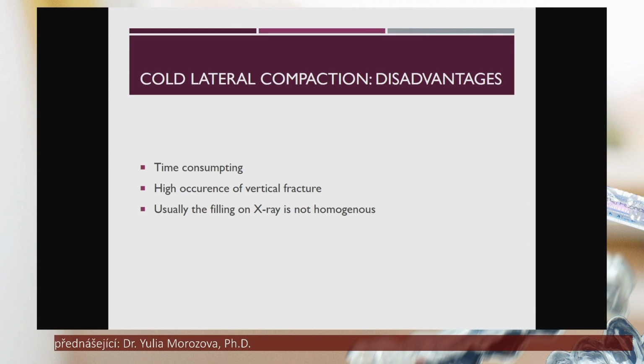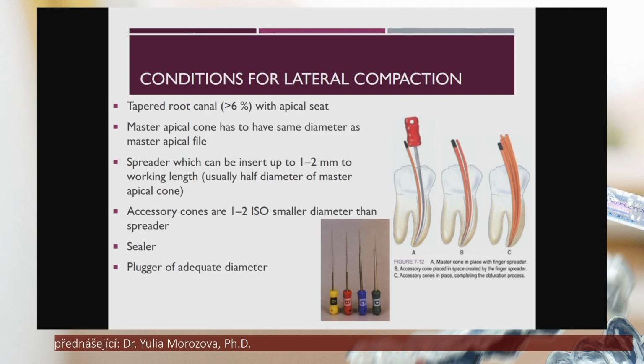And with respect to disadvantages, this method is time consuming, and because we use some strain, some pressure onto the root canal, there is a high occurrence of vertical fracture, and usually the filling on the X-ray photo is not homogeneous. So what will we do when we decide to fill a root canal using cold lateral compaction of gutta-percha.